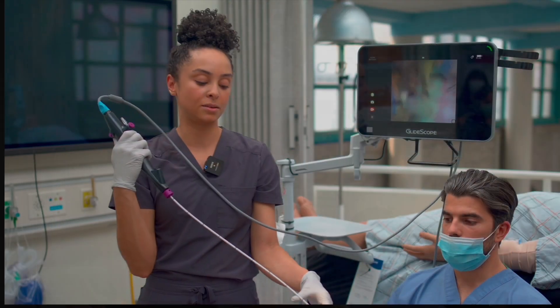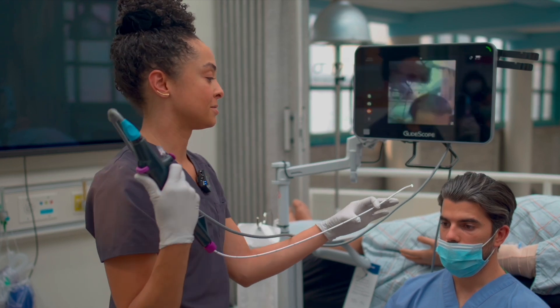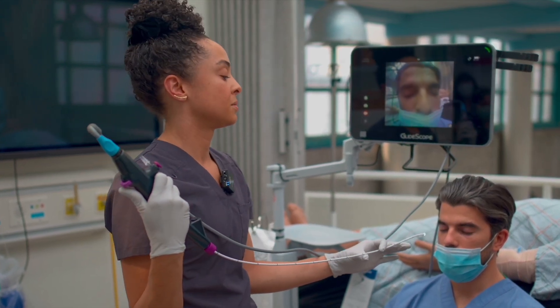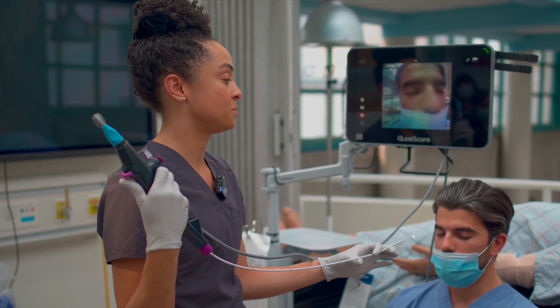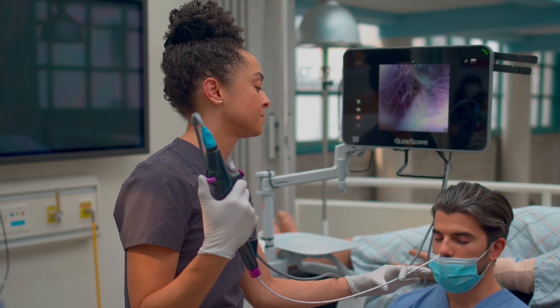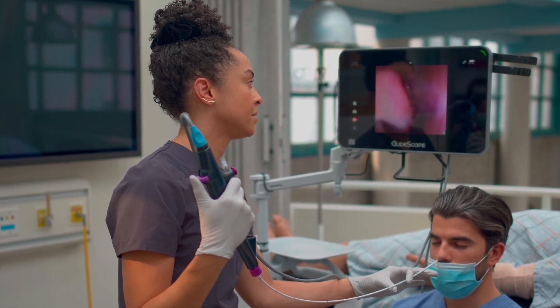All right, so next — I feel comfortable with the way I'm holding the scope, I know which way the lever is going to go to make it go up and down. Next I'm going to look in each nostril and see which side has more space. I'm going to start by looking in the right nostril. On the left of the screen you can see the inferior turbinate.